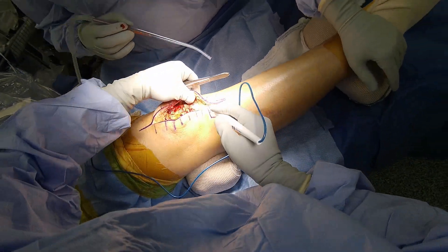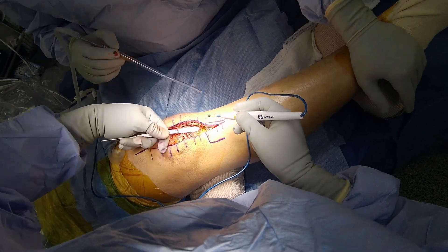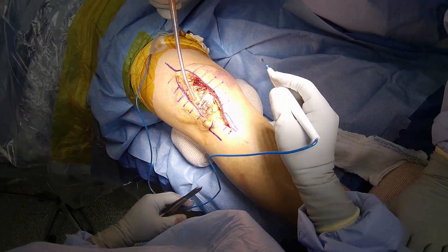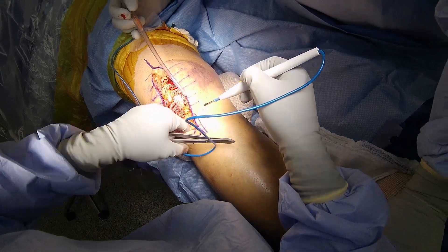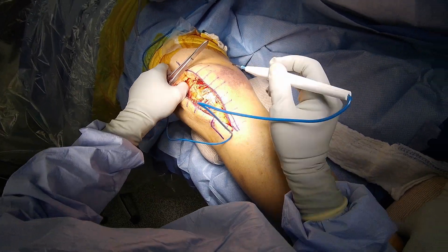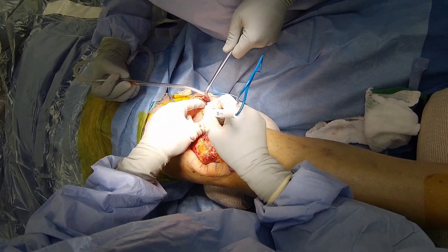Then I switch to cautery to elevate the adhered and inflamed skin and subcutaneous tissue, as a full thickness layer to preserve the integrity of the skin and optimize the closure. I want to get all the way to the gutters immediately because it will give me better visibility during the surgery and I know I will eventually need to repair the retinaculum to the gutters as well. I spend some time suctioning the hematoma and continuing to free up the adhesions, keeping the layers full thickness and avoiding any rent in the skin or damage to the deep layers.